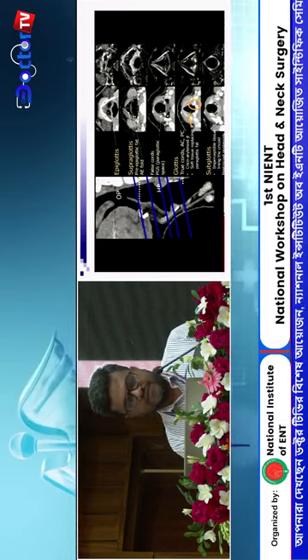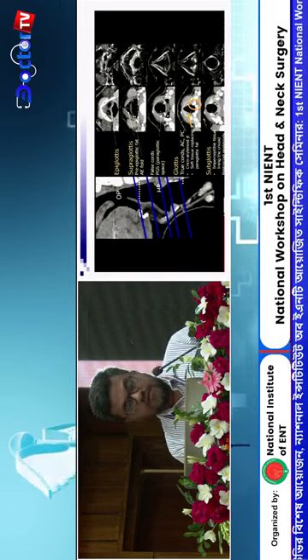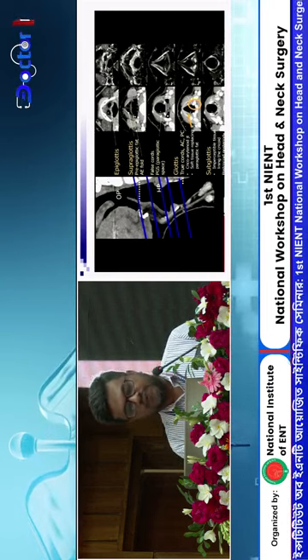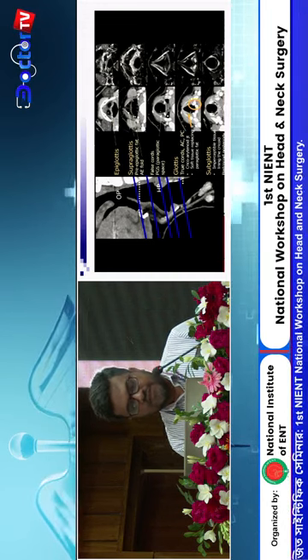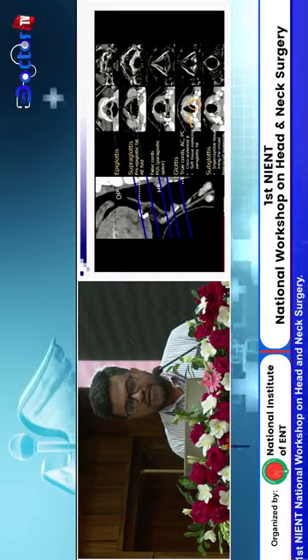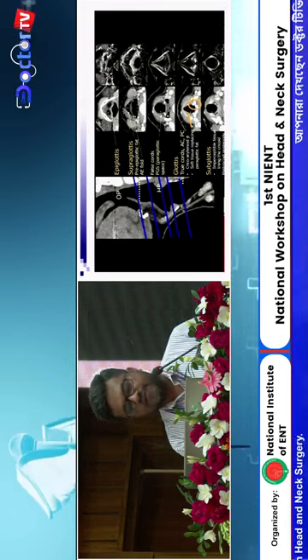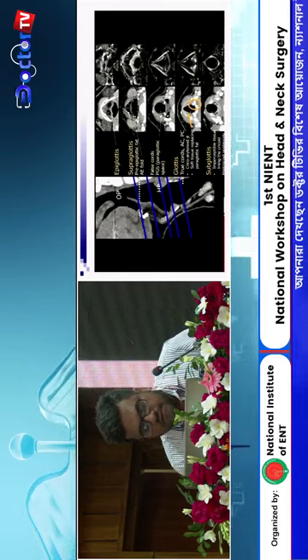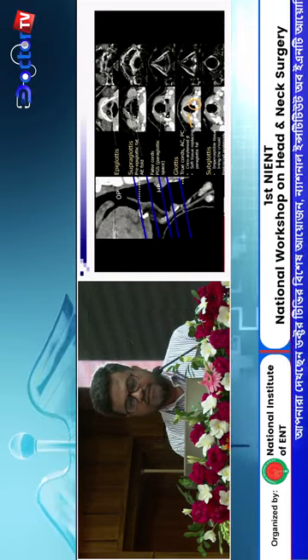In axial images, we first draw a section at the level of the hyoid bone. Here you see the uppermost part of the larynx. It is the epiglottis. The midline structure is the median glossoepiglottic fold, and the two air density areas are the valleculae. Here it is T2 MRI. Same, the supraglottis area, the valleculae, epiglottis, and the vallecula.